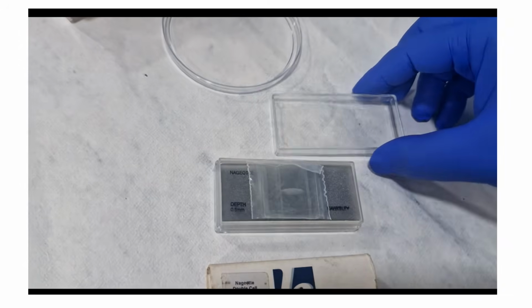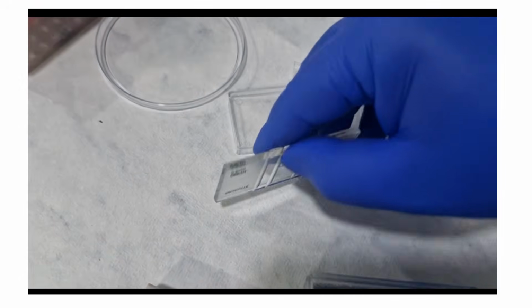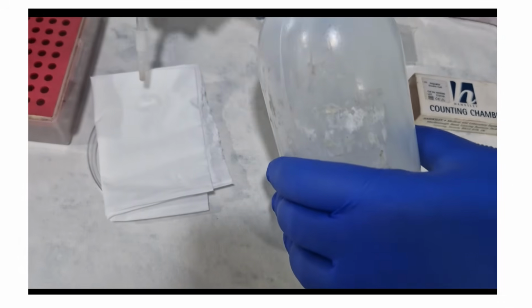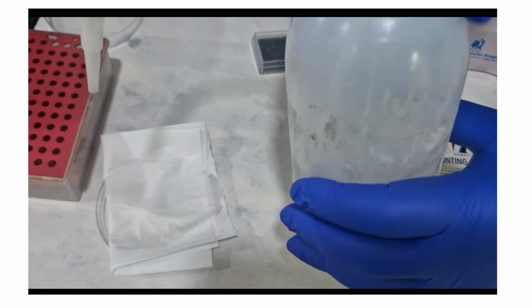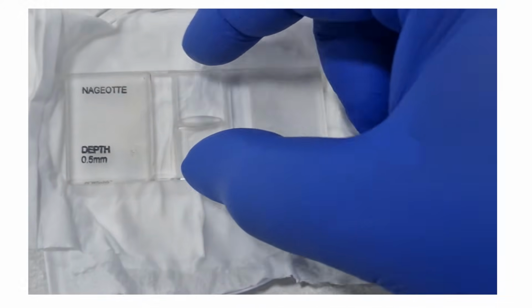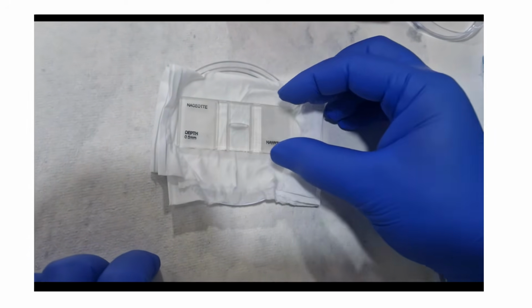This is a Nageotte's counting chamber. Place it on a moist petri dish to prevent evaporation. Place the cover slip on the Nageotte's chamber.